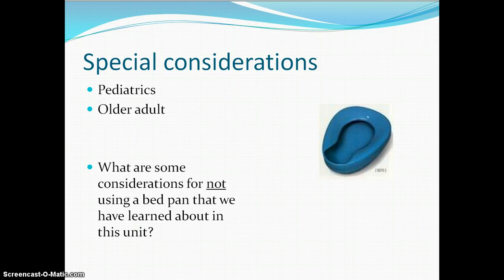Some considerations for not using a bedpan. You can see a typical bedpan here. There is a different one that's much flatter called a fracture pan, and that would be used for a patient that's had a hip surgery, and it's much flatter and easier to lie on. There are tricks to using a bedpan without spilling them. One is when you roll them on and off of the bedpan to hold on to the bedpan so it doesn't roll with the patient. And then when you set that on the floor, don't step in it. It's very easy to be doing your peri-cares and step into that bedpan. So you have to be very careful. It's just kind of one of those tricks that you learn through a lot of good practice.